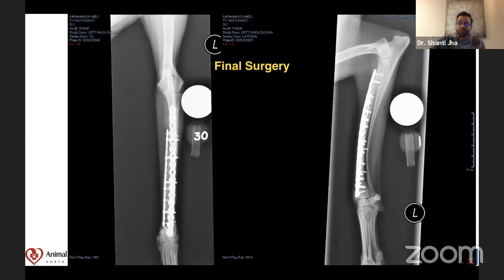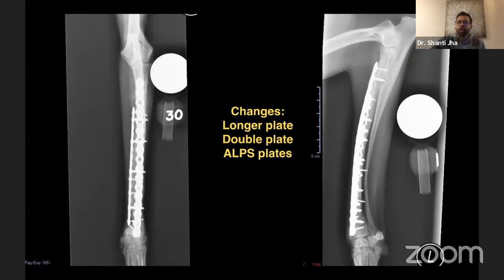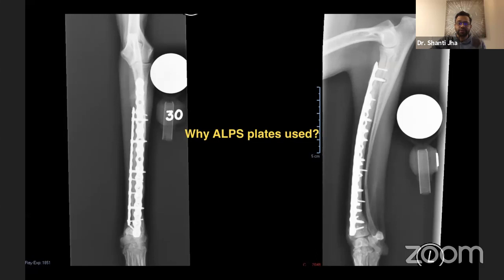So he put two plates, one on the cranial, one on the medial, and that's the ALPS plate system. It is a different Swiss plate system, like a locking plate system, but it gives you a little bit more room for periosteum to heal. I do not use this system, by the way. So a longer plate, double plate, and the ALPS plate system was used. Dog actually healed completely well. Why ALPS? Well, I ran out of options, and the other plating system wasn't working, the ESF wasn't working, and I wasn't going to plate just a standard LCP.